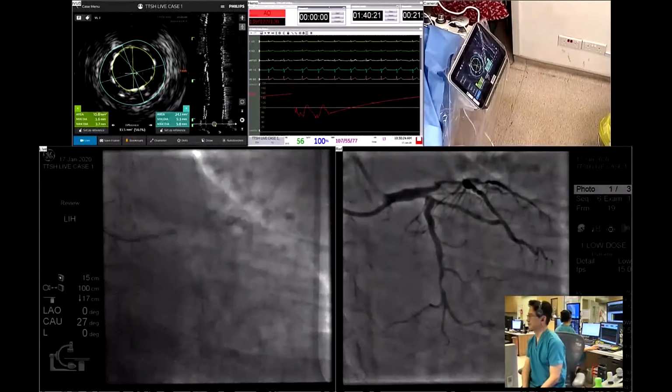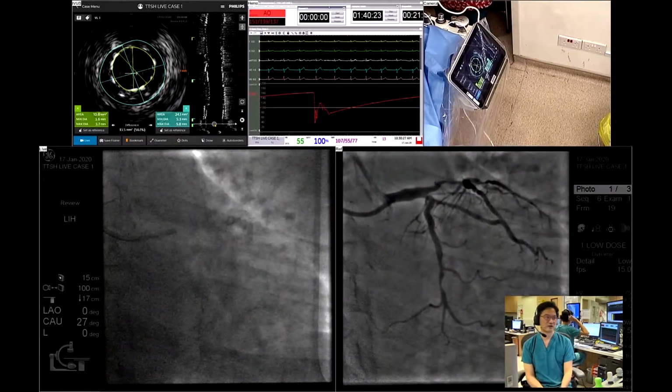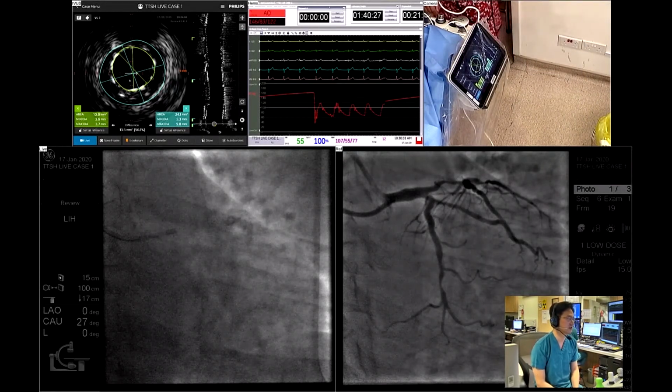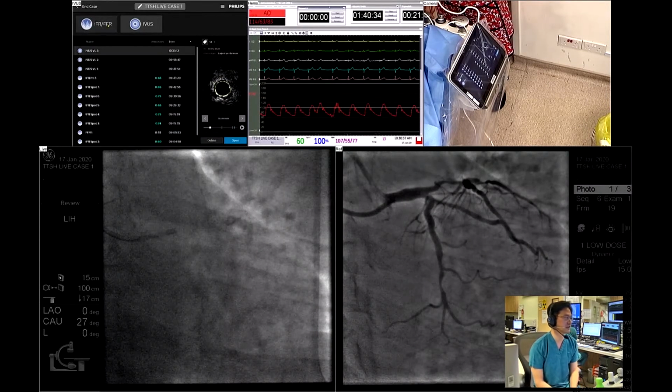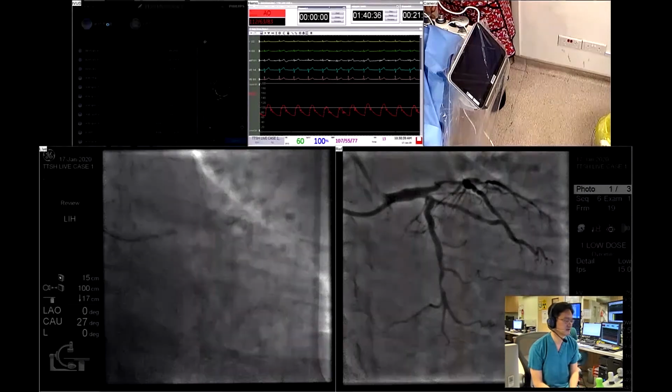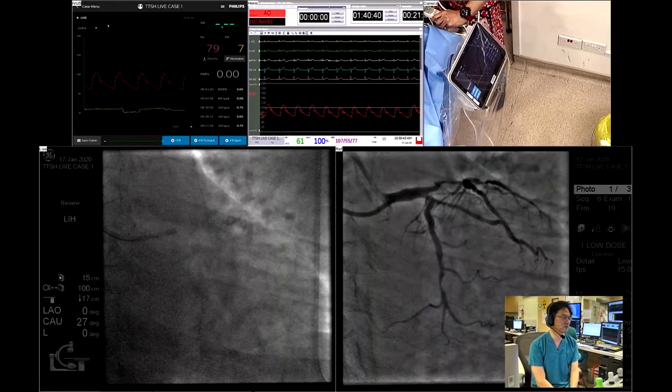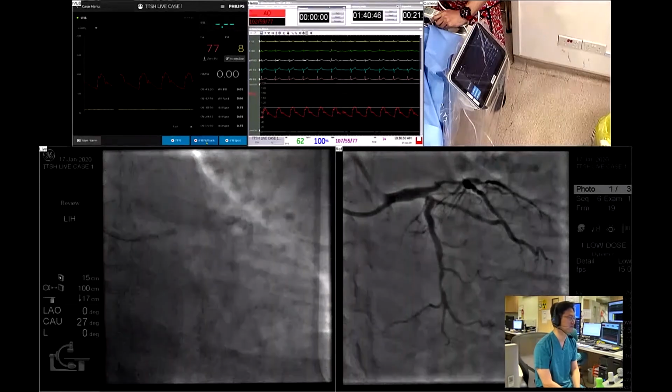We have some time, right? We can do the iFR, right? Or you have a lecture as well. So, Kaiwa, why don't you do your talk while I put the FFR down, and once you've done your talk, then maybe we'll come back to me and I'll show you again. Would that be okay? Yeah, fine. No problem. Everyone okay with that? Yeah. There's no point in seeing me putting FFR. So if I do that offline while you give your talk, then I think it's all in order. Would that be okay? Yes.